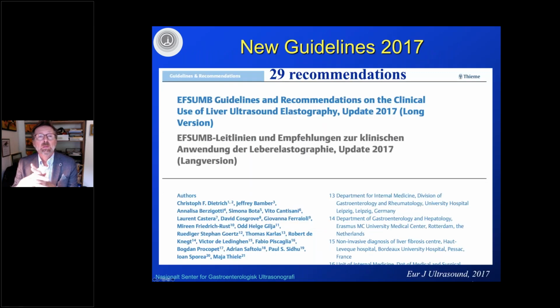We have in the European Federation of Ultrasound given out several guidelines, and the last one on the liver was in 2017, where we had 29 recommendations of how to perform and how to use elastography for chronic liver diseases.